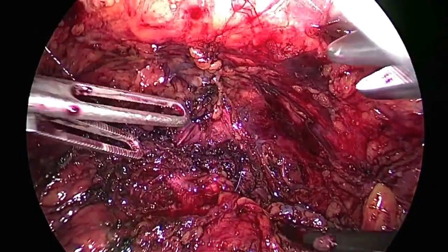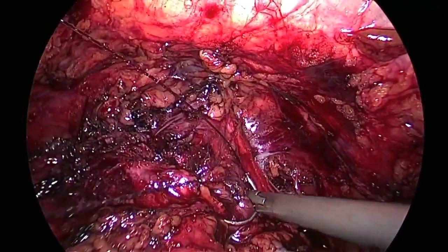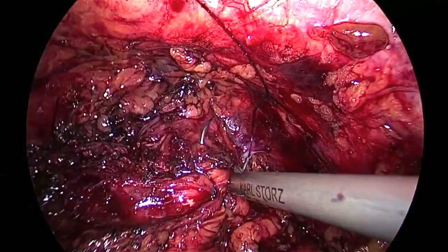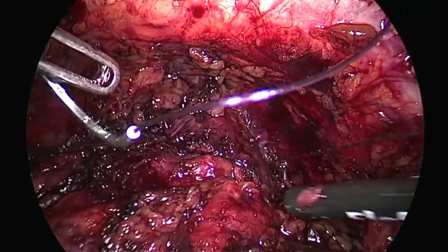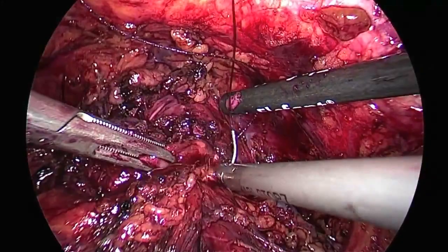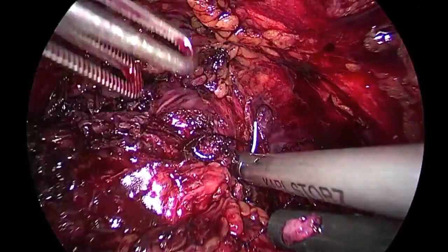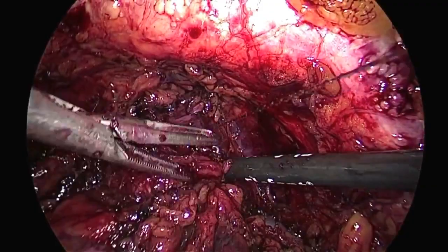There is a learning curve, and in my experience we need at least 40, 45 adenomectomies before offering good results in terms of less invasiveness to the patients. I arrived at offering this technique after I matured a good experience with radical prostatectomy, so for me it was not a problem to pass from radical prostatectomy to simple prostatectomy. When I began my experience with this technique, it was a little more difficult, because the reconstruction was more difficult as we did not have the block.